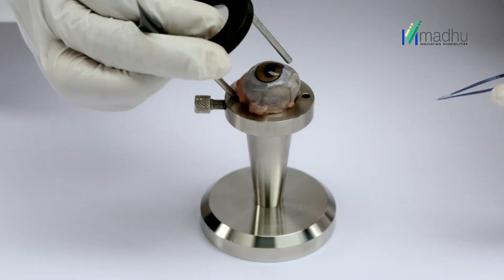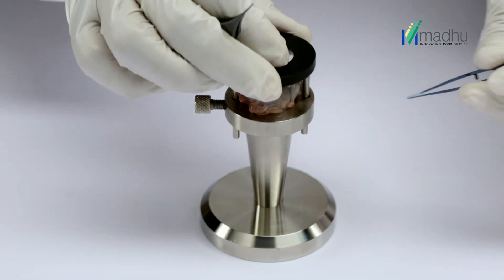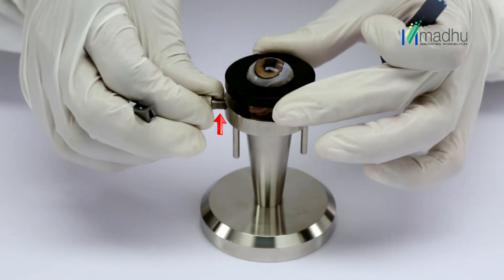Carefully place the top fixation ring pins into the guide holes. Lock the side screw and check the eye pressure.